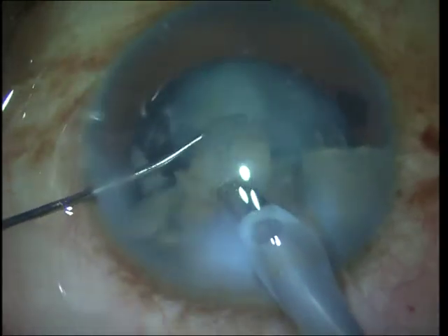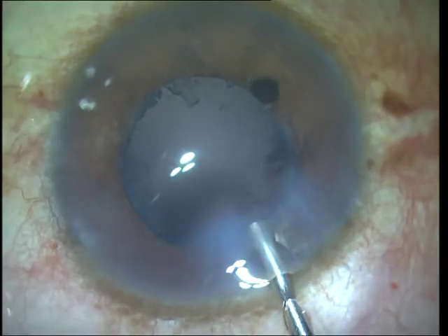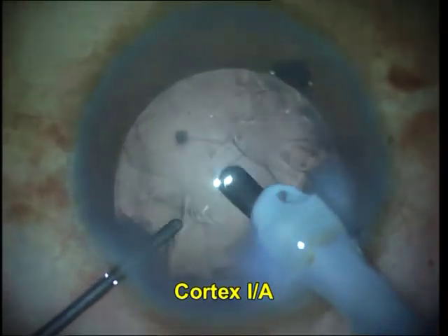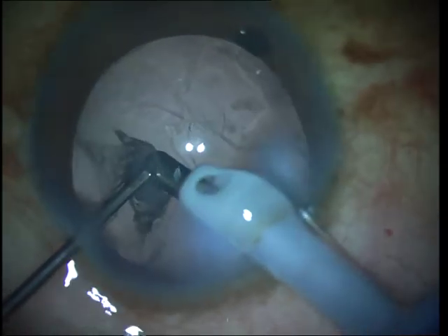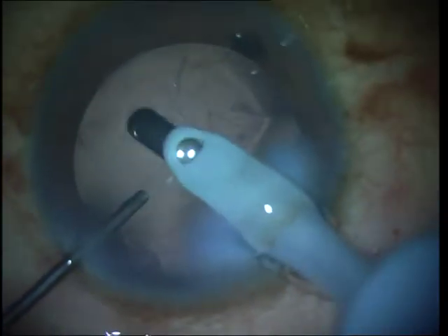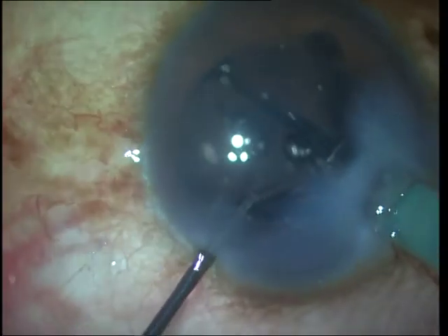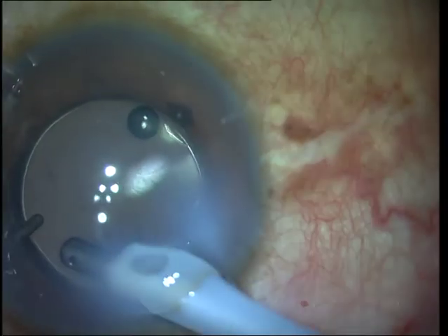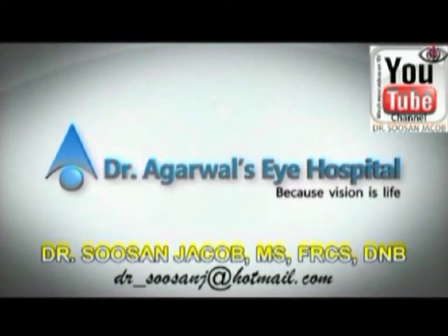All the precautions mentioned previously are taken, and there is generally very little cortex in these cases which can be easily removed. The capsule polishing mode may also be used effectively to remove any stubborn wisps of cortex. Once cortex aspiration is done, the intraocular lens is injected into the bag. Since white cataracts are generally brittle, they can easily be removed and you generally get very good results. I hope you enjoyed watching this video - for more learning videos on phacoemulsification and complex cases, please watch my YouTube channel. Thank you so much.